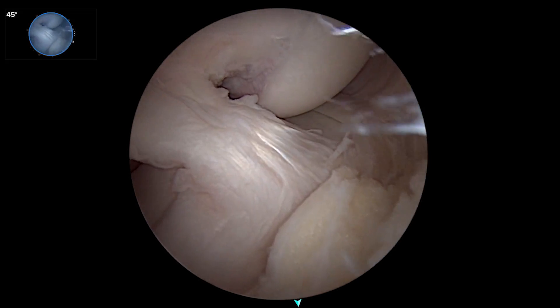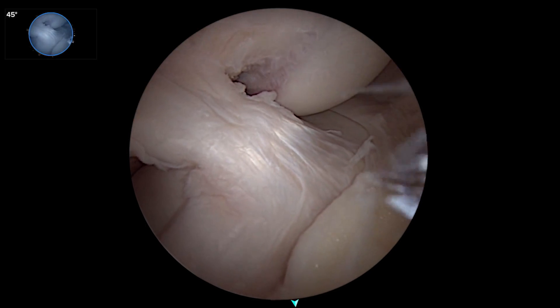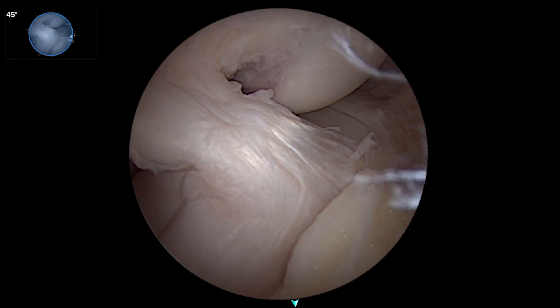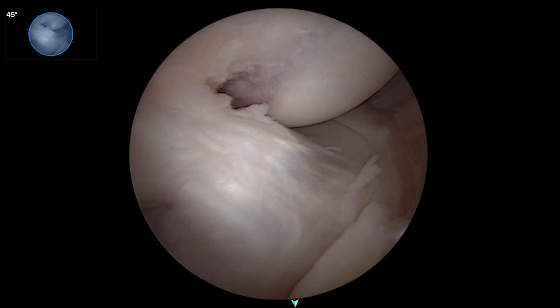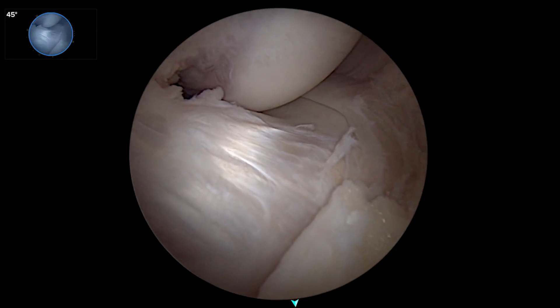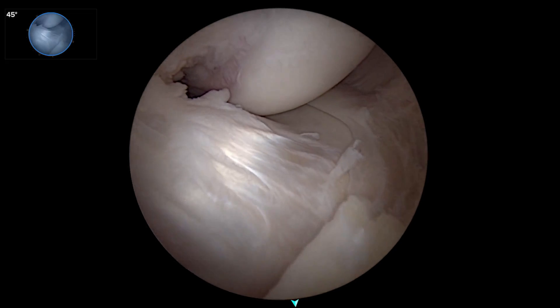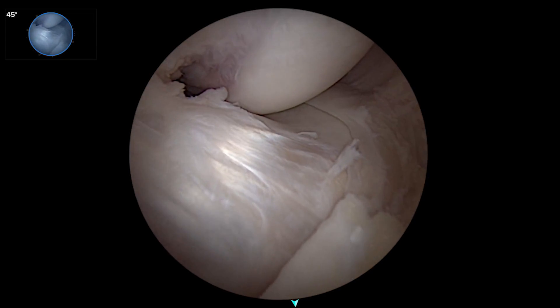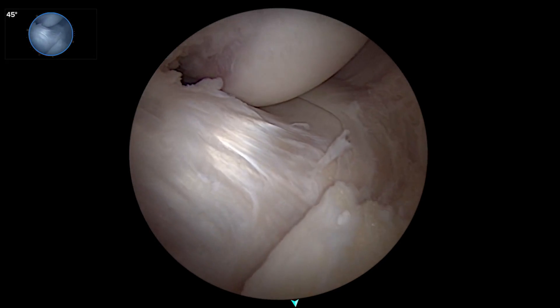And the ACL insertion. This view will be particularly great when we're doing meniscal transplants combined with an ACL, where there's not much room between everything we do. This is the best view I've ever seen of that — to plan where the tunnels for these two procedures are going to be without intersecting each other.